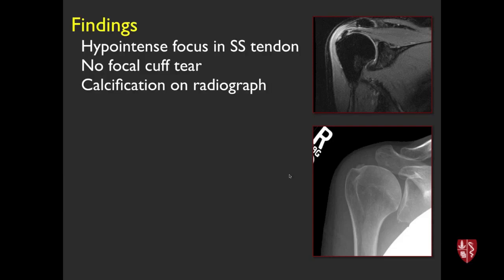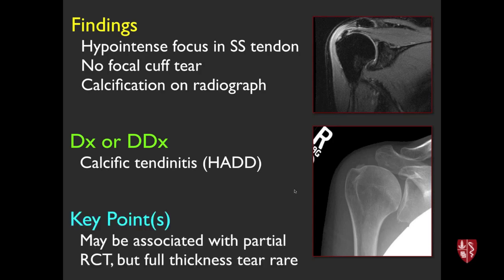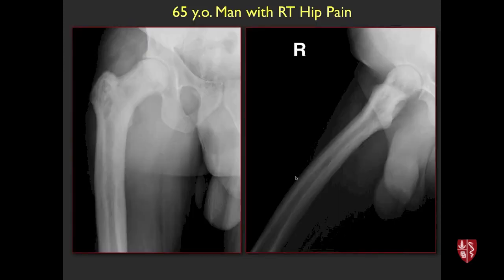Coronal MRI and radiographs here. There's a hypointense focus in the supraspinatus tendon with no obvious full cuff tear, and there's calcification on the radiograph. This is a classic example of calcific tendonitis — hydroxyapatite deposition disease. One useful point: it's very rare to have a full thickness tear when you identify HADD. There may be partial thickness tearing, but usually patients present with pain before the cuff is completely torn.